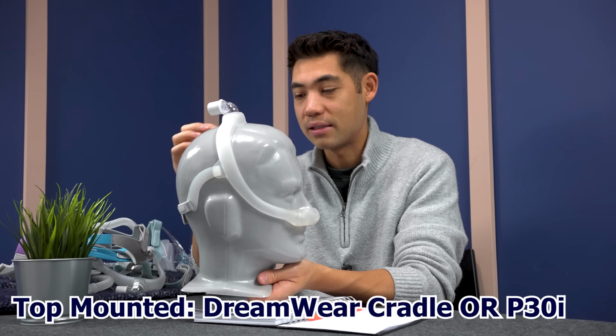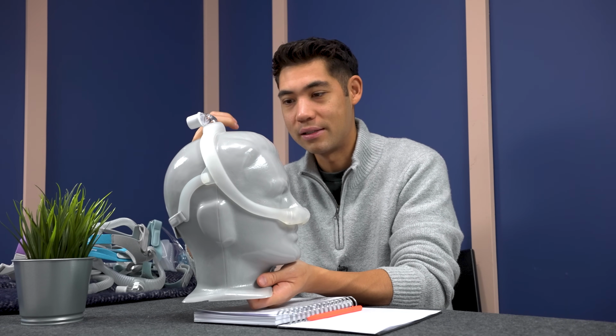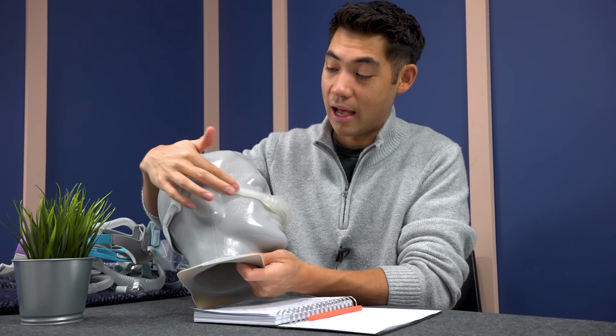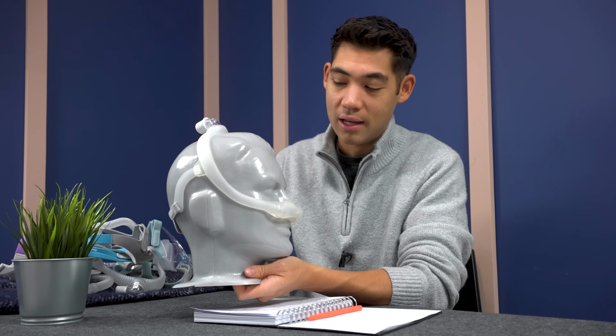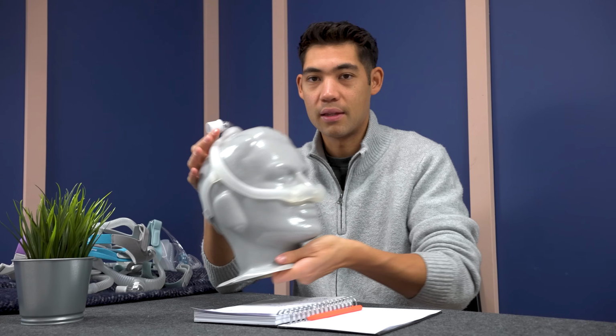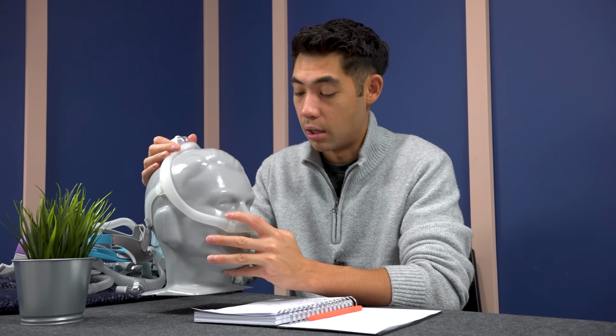Again, with the top mounted mask, I know we talked about the P10 being elastic and not having very many adjustment points, but because top mounted masks have the silicone rubber going kind of on your hair and then on your cheek, it's actually super, super grippy. And although it's super simplistic, it's very grippy and doesn't really move too much at all when you're wearing it.